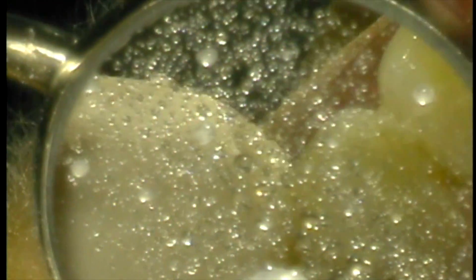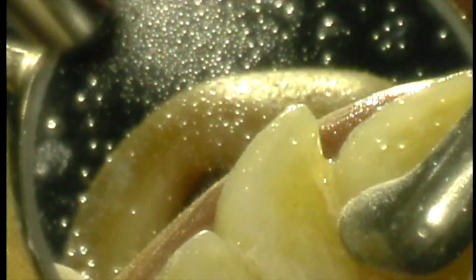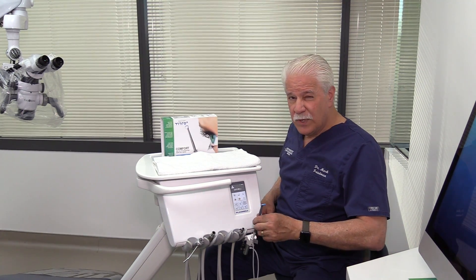For ergonomics, for quality of dentistry for your patient, for comfort, for reduced stress, you need to be able to see. And so this system is really well designed.